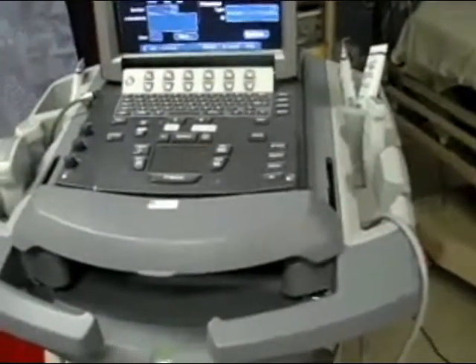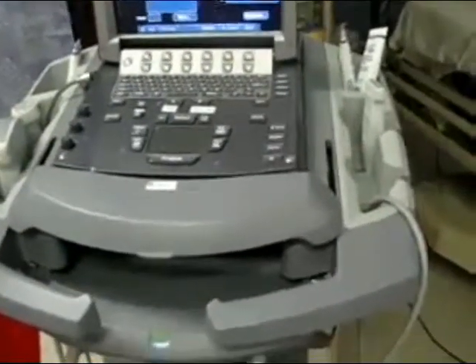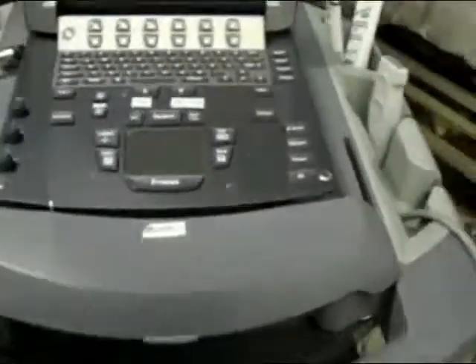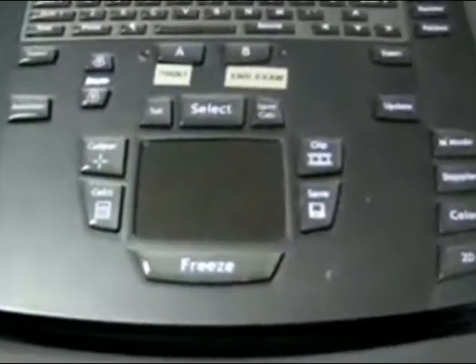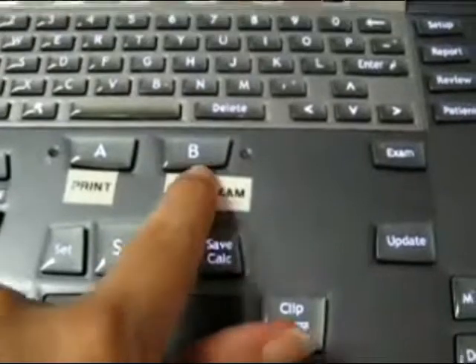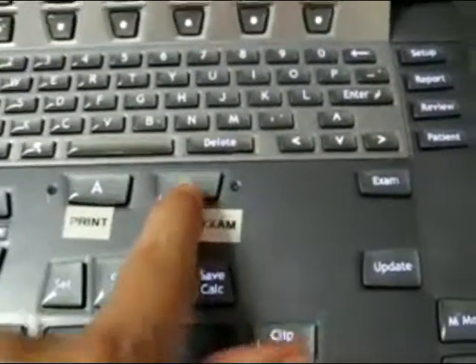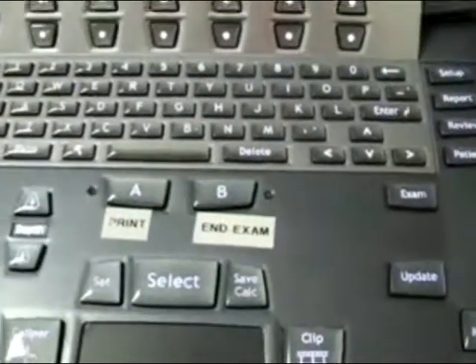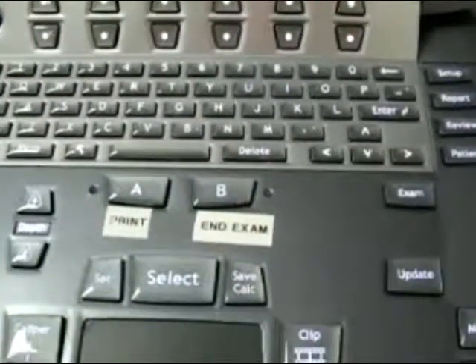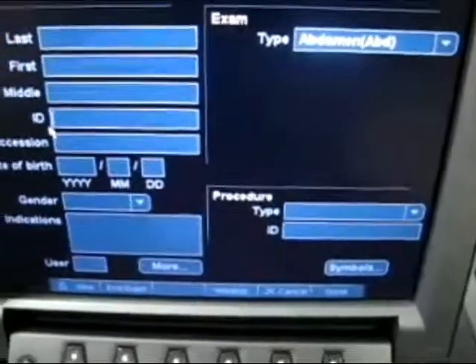Before you begin your FAST exam on a patient, please go to the machine and close out the exam that was done before you by touching the end exam button, which can be found under button B. That automatically closes out the exam that was done before you and clears your screen.